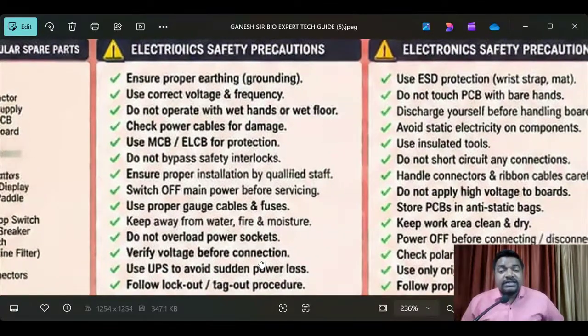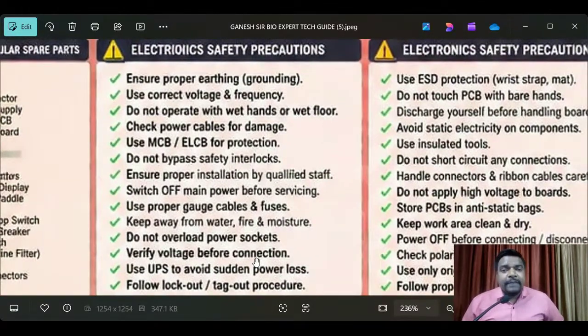Okay, so these are the things you have to follow. At the same time, you have to give instructions to the hospital mammography technician. On a weekly basis, you have to give user training and maintain the documents. Because at any situation, any problem can come, and that is not in our hands. But whenever a problem comes, then we have to repair, and that is within our hands.